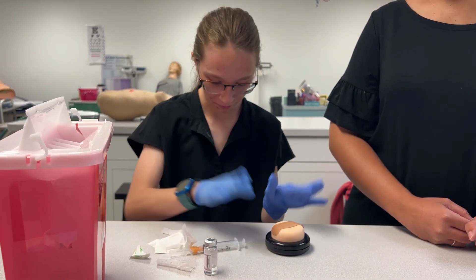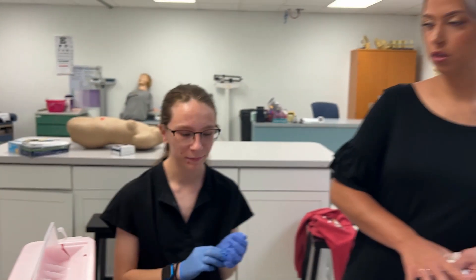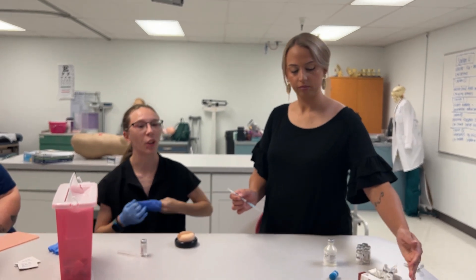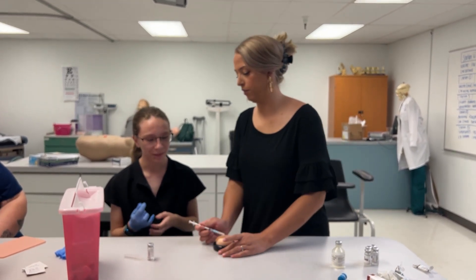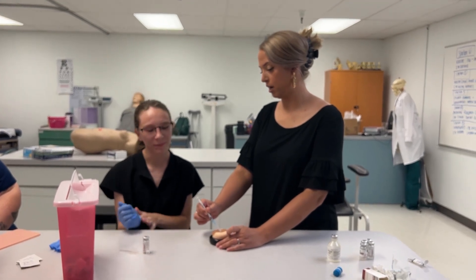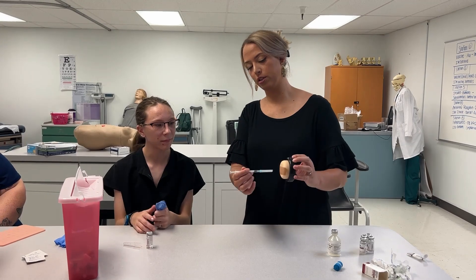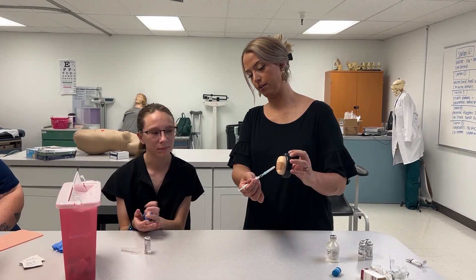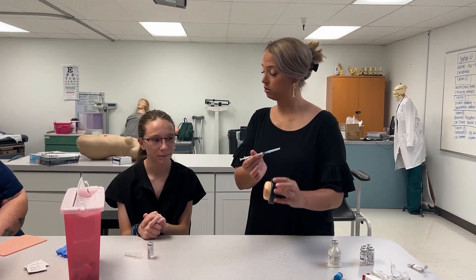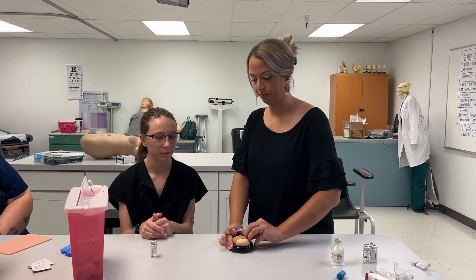When you went in at the angle, you kind of went in more of a 15-degree angle rather than 45. Here's 90, here's 45, here's 15. So if we're holding this up, we want to go more of this kind of angle — about 45 degrees. But your swiftness was good; that'll be good for not hurting your patient.